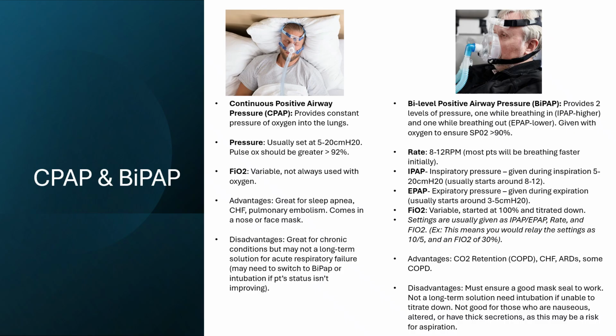Advantages of this: patients that have CO2 retention, like COPD, this is a great option because not only is it going to force air and oxygen into the lungs, it's going to force air out of the lungs just to help make sure that they're getting good gas exchange and exhaling what they need to exhale so they don't retain CO2 and get a buildup of that. So it forces air in, forces air out. It just gives patients a little bit more support.